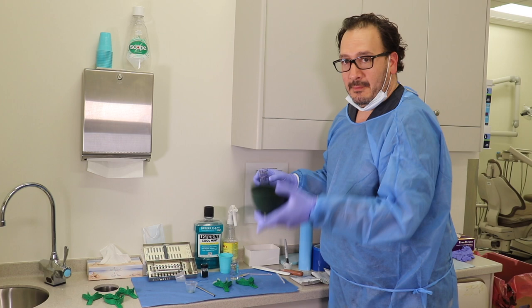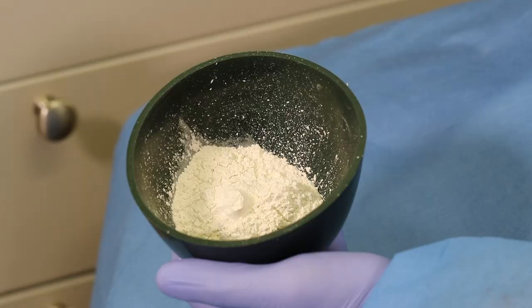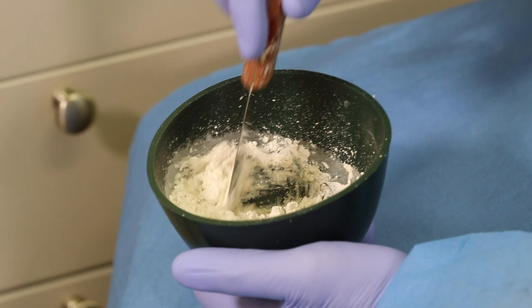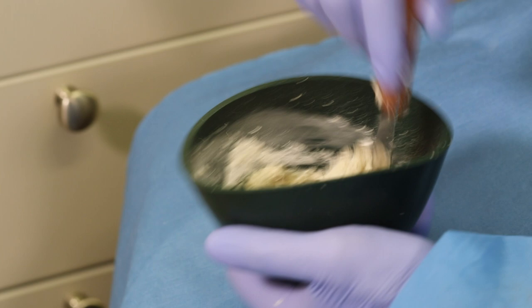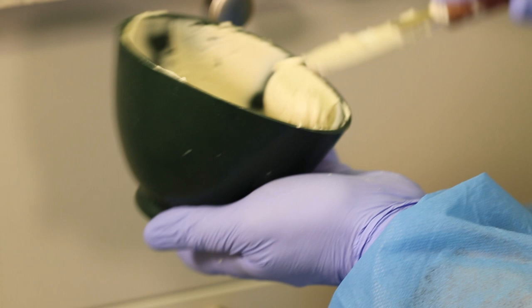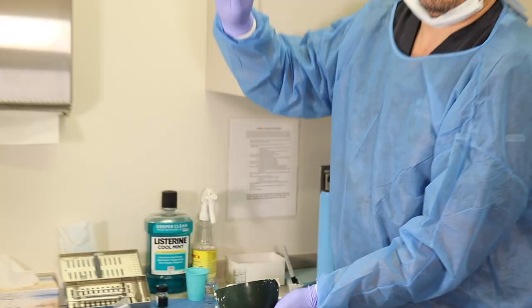And what I'm doing is, I incorporate the water onto the powder. And at the beginning, I like to incorporate it and start mixing. Once I get a thick mixture, then I go to the walls of the bowl, trying to make a more consistent mixture of alginate, okay? As I do this, I'm getting a more homogeneous consistency, and if you see, it's not runny, okay? This is the consistency I'm looking for right now, okay?